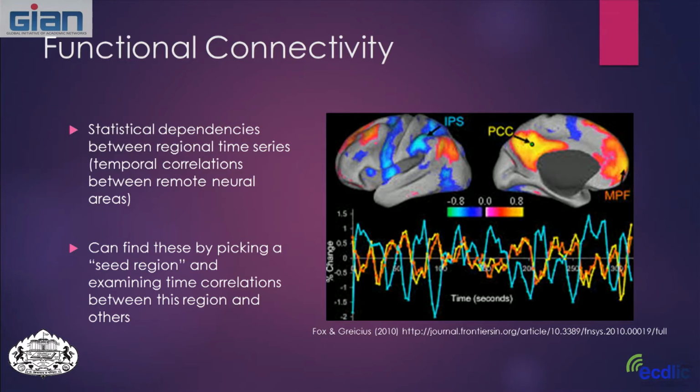So people have done a lot of work studying these types of functional connections and see that if we pick a region of the brain and do correlation analysis over time with different regions, we see that different parts of the brain that aren't connected anatomically are working together to accomplish a task. And like I mentioned, we're going to talk about these functional connections a little bit more.